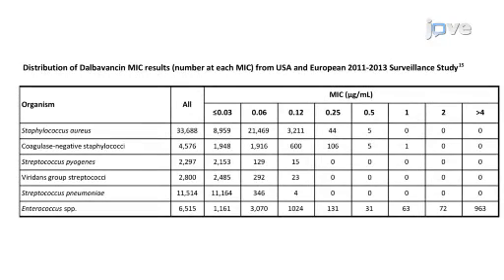In addition to validating the method using quality control organisms, dalbavancin MIC data from regional antimicrobial surveillance programs can provide a basis for MIC results to expect in the clinical laboratory setting. As shown here, dalbavancin MIC results for isolates collected in Europe and the USA in 2011 to 2013 were less than 0.25 micrograms per milliliter for 99.9% of S. aureus and 100% of streptococci.